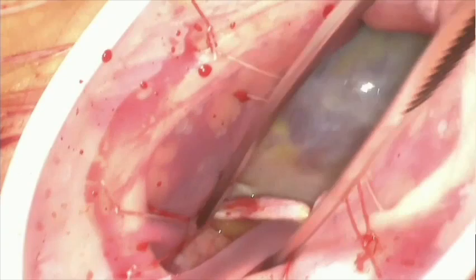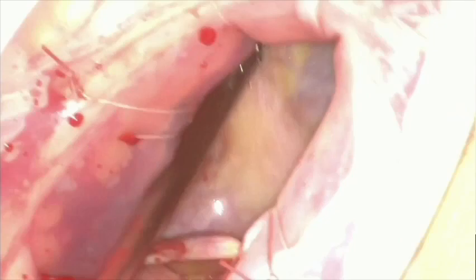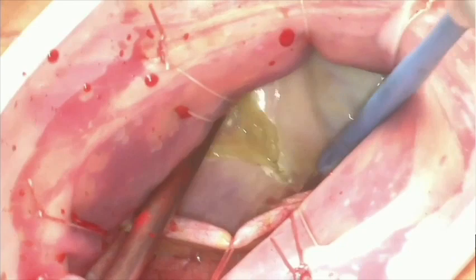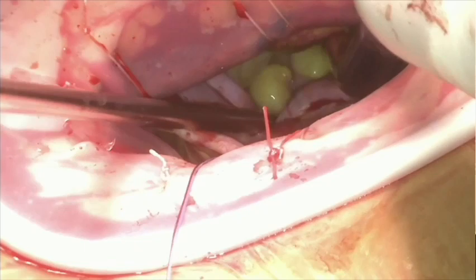We place a soft tissue retractor. Here we open the pericardium and position 7 pericardial stay sutures — always 3 anterior and 4 posterior, strongly tied up to the skin — as a means to bring the heart as close as possible to the surgeon. This is the CO2 line. We then prepare the interatrial groove, and here you see the transverse sinus.